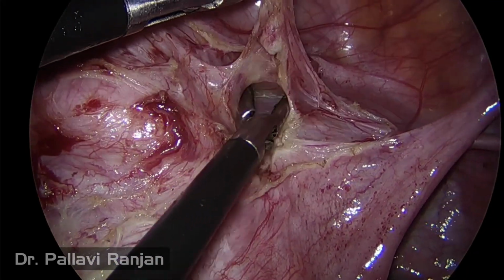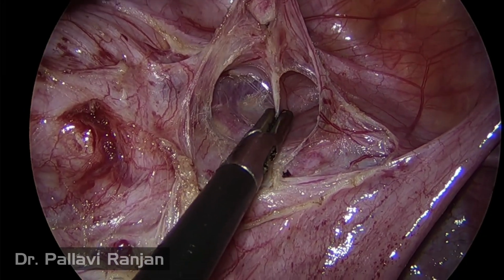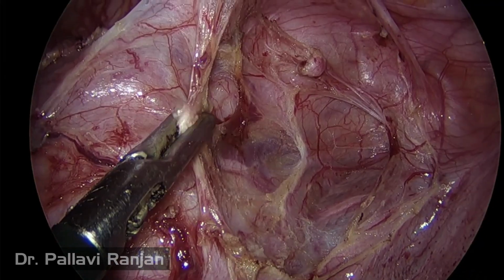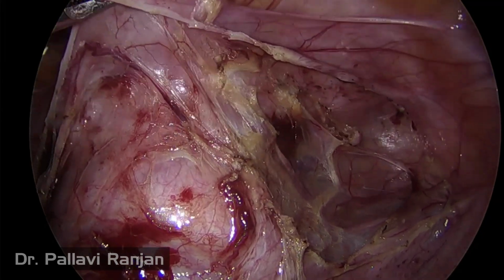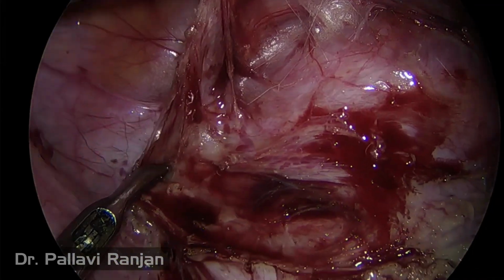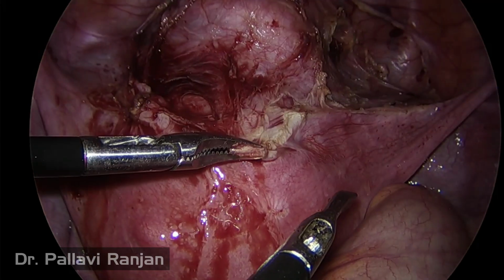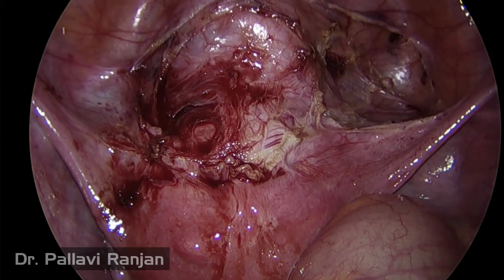We are going step by step, doing dissection in small bits and pieces, identifying the tissue and separating them with the bipolar shearer cutting current. So here we have completely separated the bladder on one side, and we are going ahead and separating the bladder on the other side. Now we have identified the area of the scar ectopic. Vaginal tube insertion also helps us in identification of the cervix, the end of the cervix.